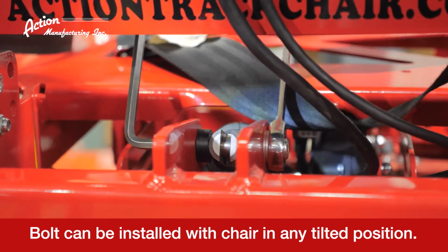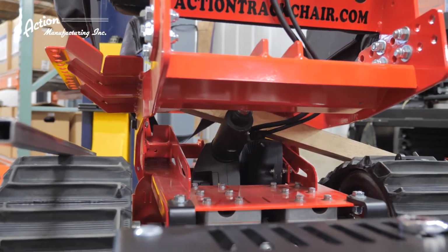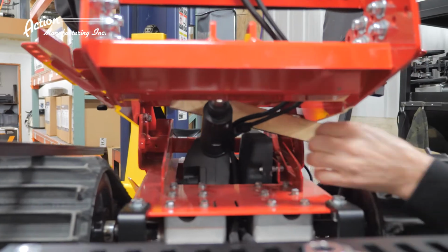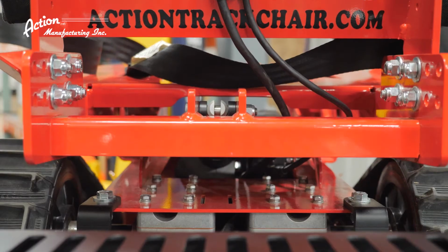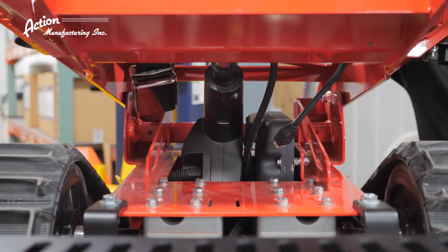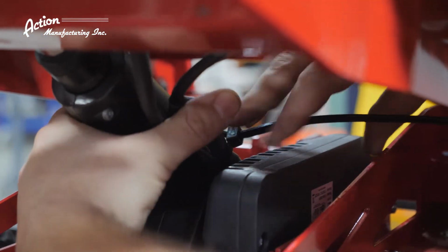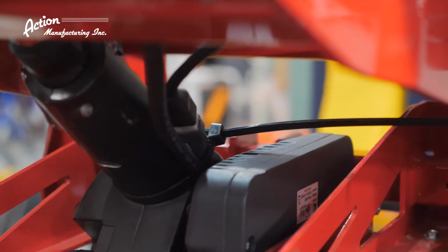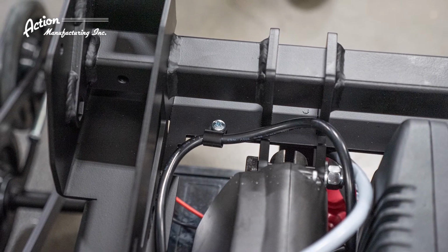Next, plug in the 6-pin connection and, if used, remove the brace and lower the seat frame back down into position. Test for proper tilt function using the tilt toggle, leaving the seat in the most forward position to complete the wiring process. Next, zip tie the 2 cables to the main body of the actuator. Install the P-clamp that secures the cable to the frame as shown.